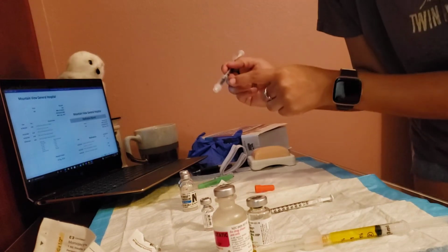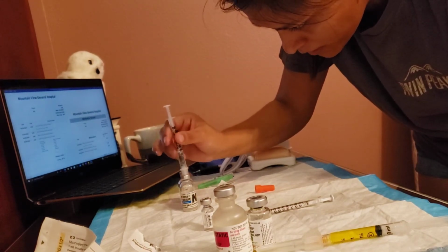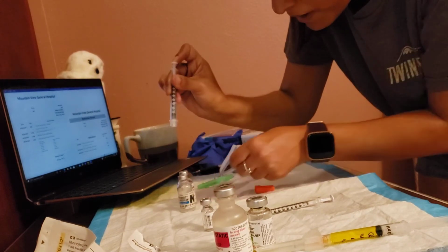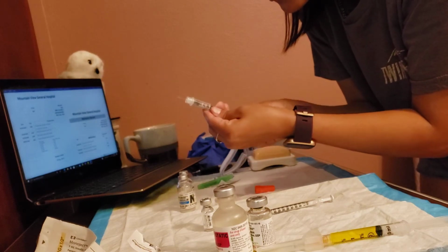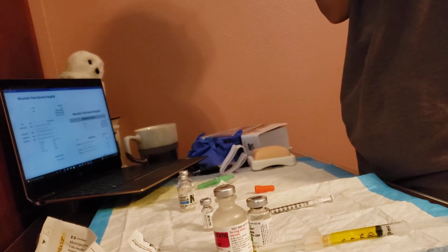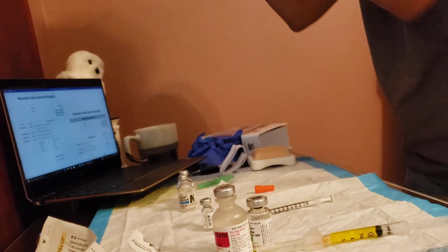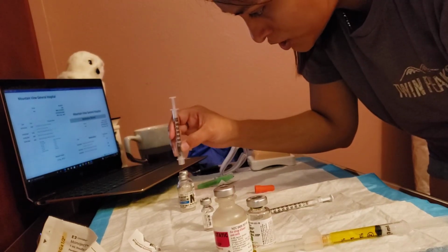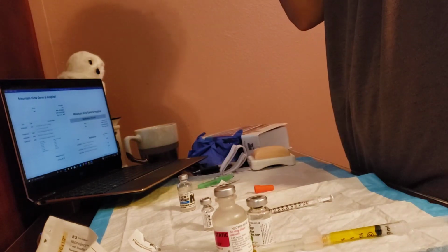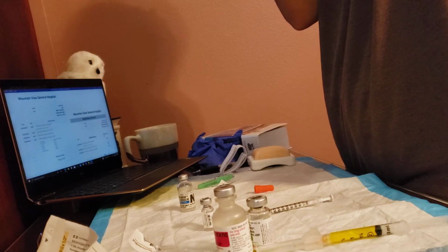These needles are very fragile, so I'm going to go to my NPH, push in 12 units of air and draw back. I'm going to grab 12 units of air for my regular, put that in gently, push in, and immediately draw my 12 units of regular insulin.